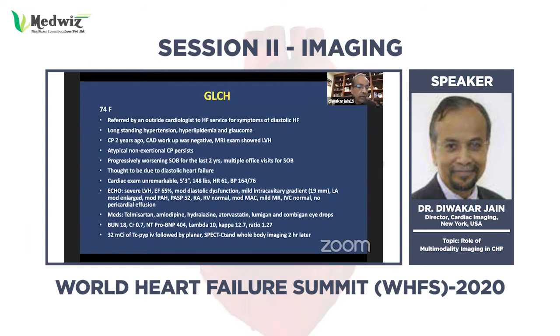Her exam was unremarkable other than hypertension. Echocardiogram showed severe left ventricular hypertrophy, preserved ejection fraction, moderate diastolic dysfunction, a mild intracavitary gradient, which would not explain her symptoms, and pulmonary hypertension. She was on multiple antihypertensive agents.